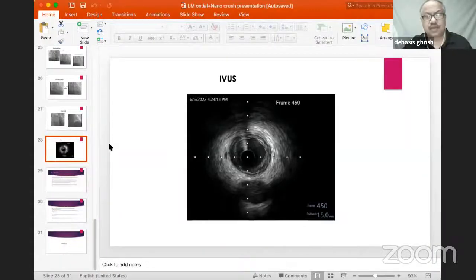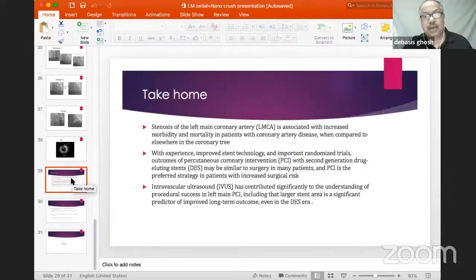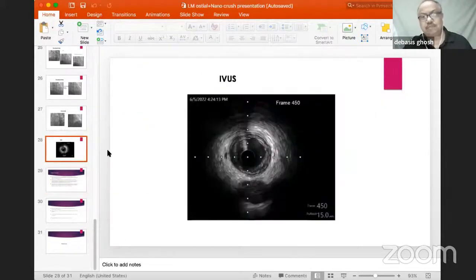LMCA lesion stenting is fairly simple, and I absolutely agree that if you do not have a significant lesion and you have done IVUS very rightly, and you have demonstrated that there was minimal lesion in the LCX, a provisional stenting strategy would be all right. The only thing is, you said you used a 4 millimeter balloon in the left main stem for dilatation. I don't remember what the IVUS was. Unlike Western patients, we do not have, say, 5-6 millimeter left main stem, but I think I would be more comfortable putting in a 4.5.